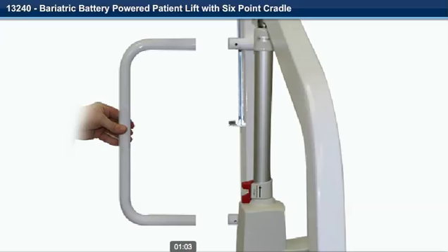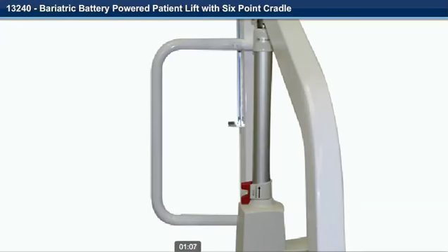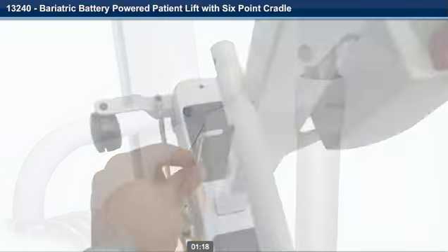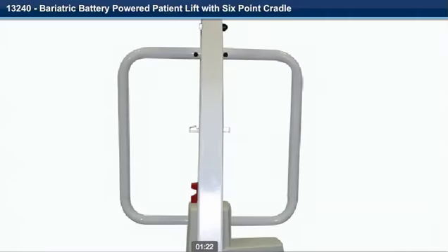Step 7. Slide one of the push handles over the upper and lower posts. Make sure the holes line up. Step 8. Install and tighten one of the Allen cap screws that were removed in the upper and lower push handle posts. Repeat steps 7 and 8 for the other side.